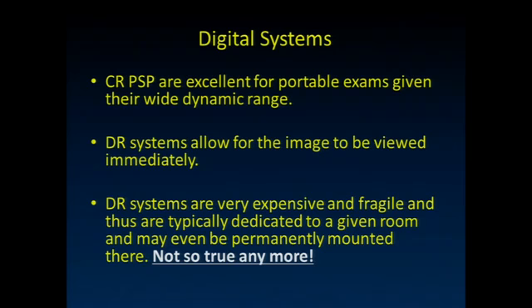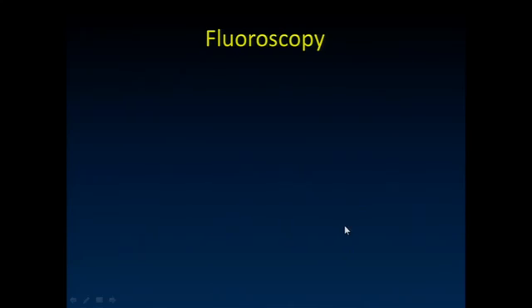if you go to some of these photoconductor materials like amorphous selenium, they're not as delicate, and so you can make a portable plate to go with. And now with wireless technology, you can make a digital plate, right? Take it up to the ICU, and once it's exposed, have that data be transmitted from the plate itself wirelessly to the network in the hospital, so you can have it in your reading room before the tech basically even leaves the patient's room. And that's where we're starting to be, and definitely where we're going to be a few years down the road. Okay, so this is not so true anymore. These systems are kind of coming in line in terms of price there.